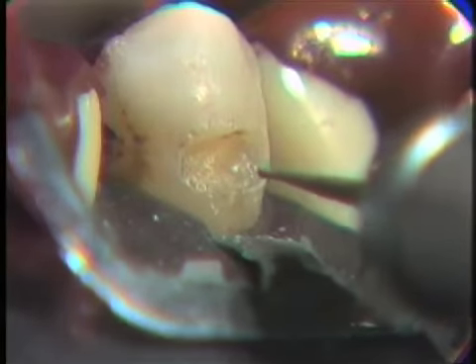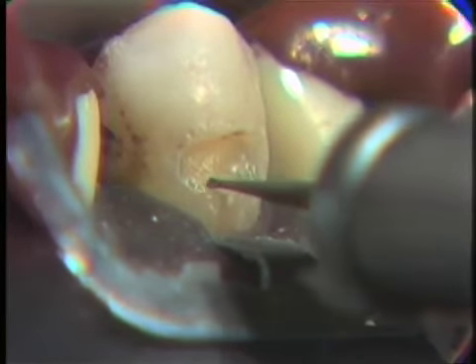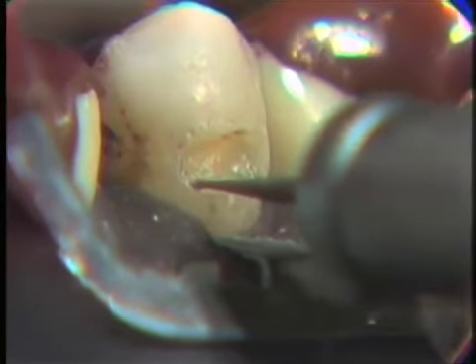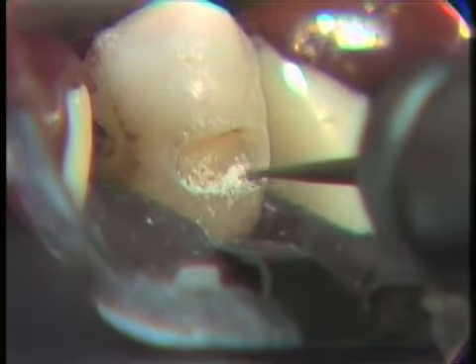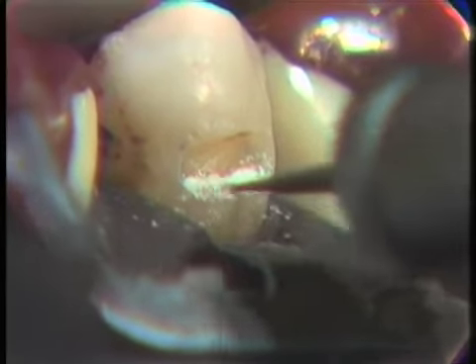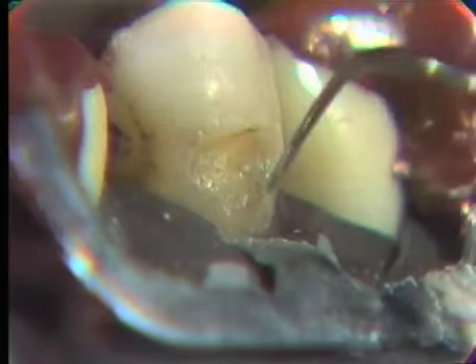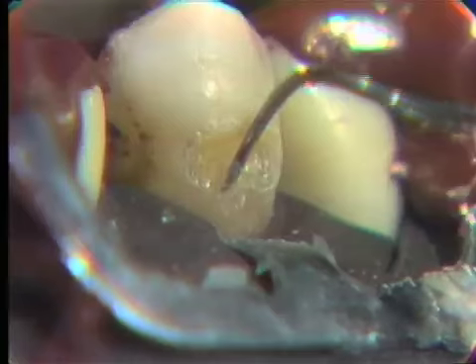So let us start now on the cervical. Feeling the wall, turning the burr on. Now we are proceeding from distal to mesial, pressing with the side of the burr against that cervical wall. What we're looking for and what we're testing is to see if we, in fact, do have the type of retention that we want. And what do we want?